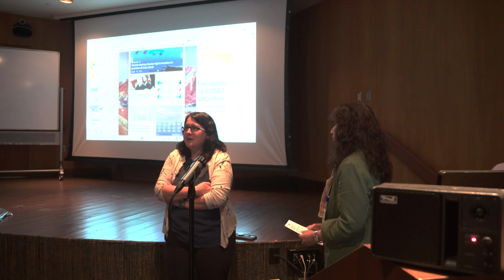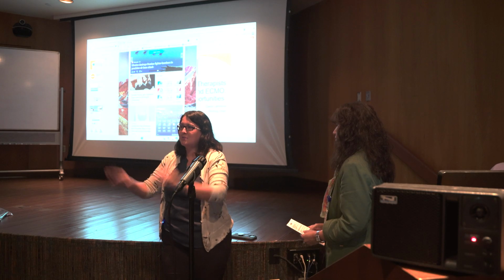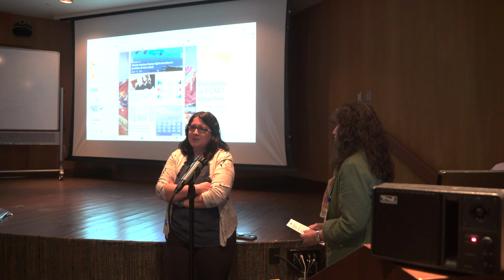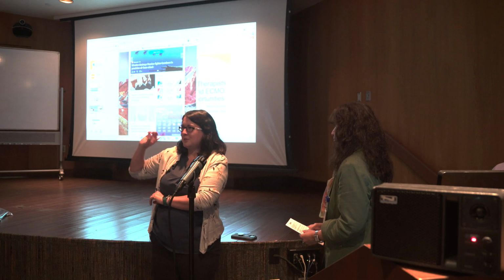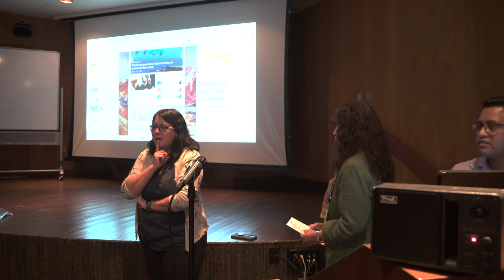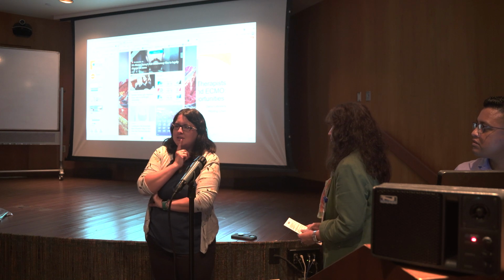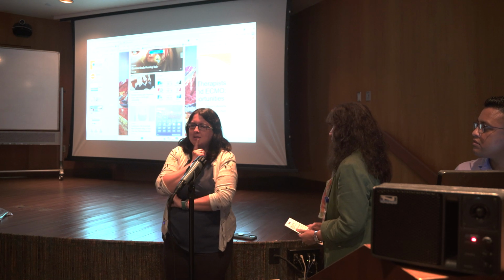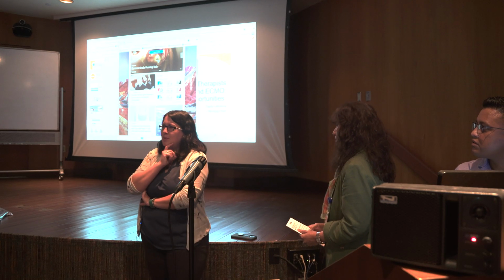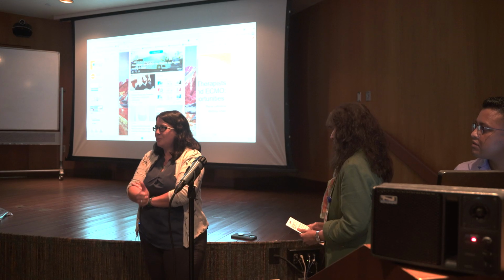We'd started to do it with ARDS patients, just any ARDS patients. And I went to the RT that had been utilizing it, and I said, what about ECMO? And there hadn't been a lot of cases with it. I will say there's a lot more going on in Europe and China. There's a really great article about a pregnant woman who I think had lupus, and they used EIT on her throughout her ECMO run, and that was really interesting. I will say it's not FDA approved for pregnant people here in the US.